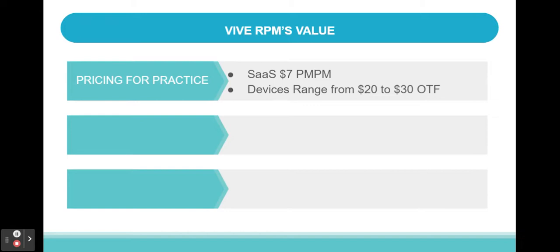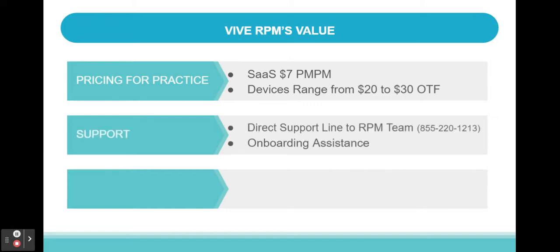RPM has demonstrated significant impact in reducing unnecessary hospital admissions and readmissions by enabling movement of appropriate levels of acute care and chronic care monitoring into the home, reducing the high costs of inpatient services. Our direct support line and assistance with onboarding helps build the clinician-patient relationship, and RPM provides more opportunities for communication, thereby strengthening the patient-provider relationship and improving patient satisfaction and loyalty.